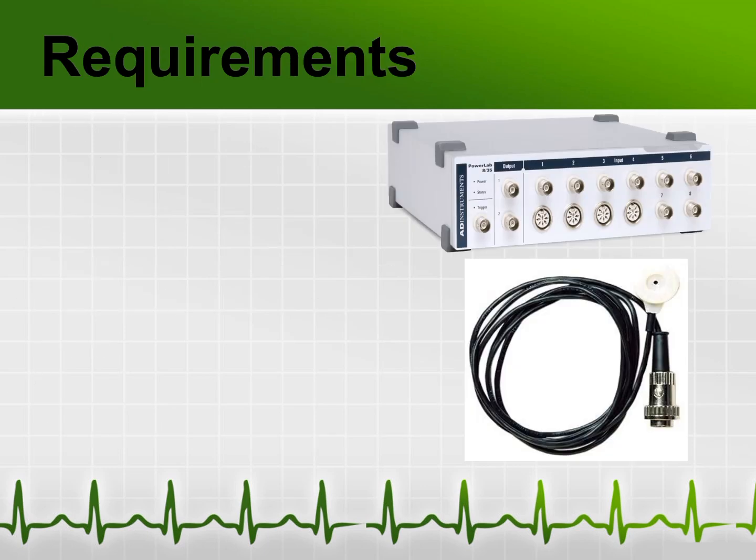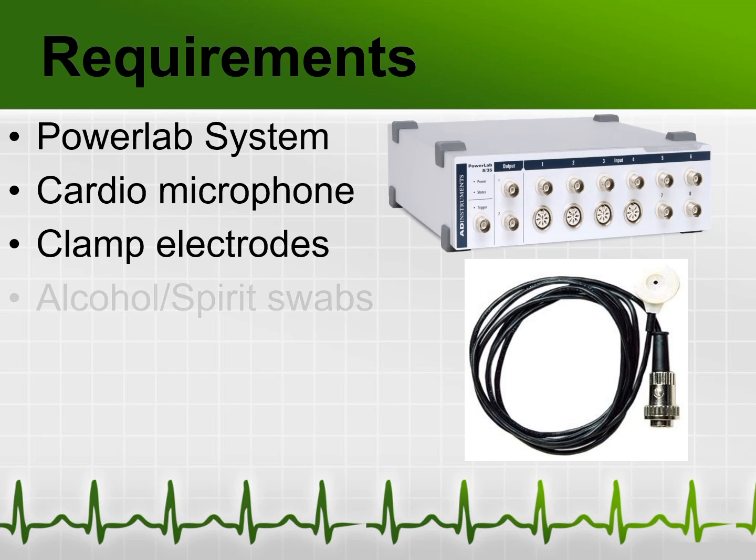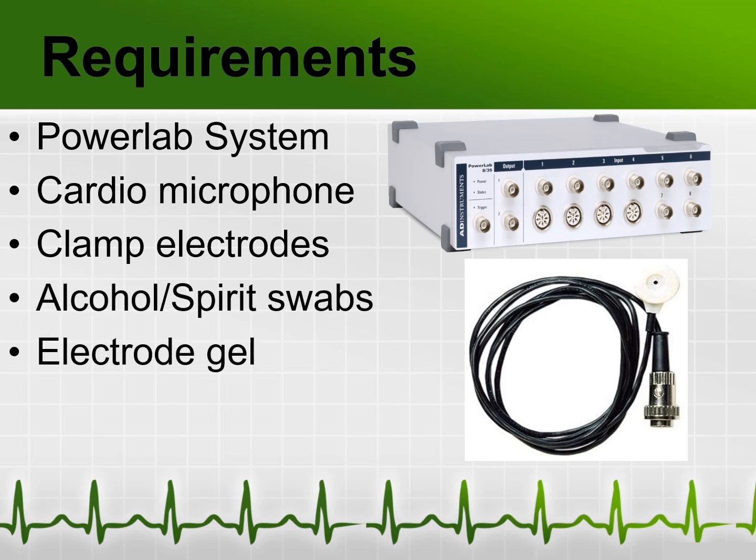What are the requirements for this practical? In order to perform this practical, you will need a PowerLab system, a cardio microphone, clamp electrodes, alcohol or spirit swabs, and an electrode gel.